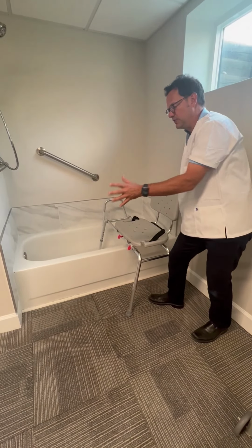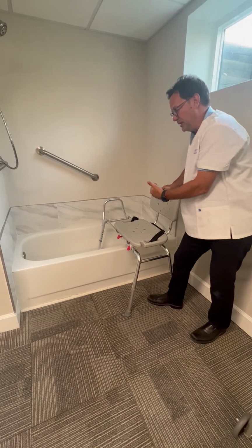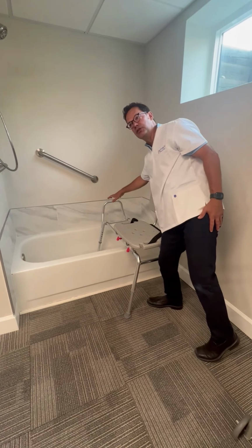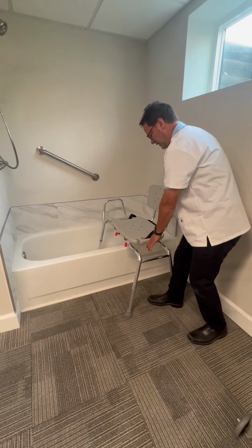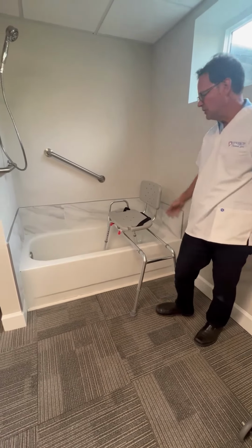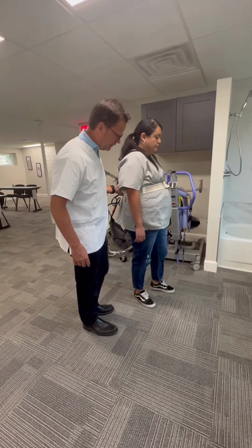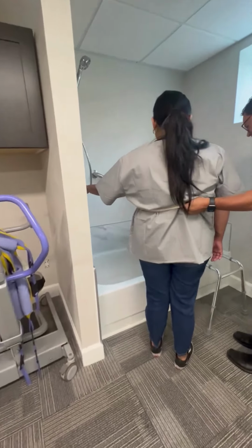Depending on how that transfer goes with a threshold like a tub, just to know that they maybe can make an inexpensive modification to the home and replace what would be a typical bench in the tub, which you'll see commonly with a device like this that allows us to transfer them outside the tub and then slide them in. So I am with Giselle. We've got a plan. I'm moving her into position. Go ahead, Giselle. And with your left hand, grab that bar, please, and then go ahead, step in.